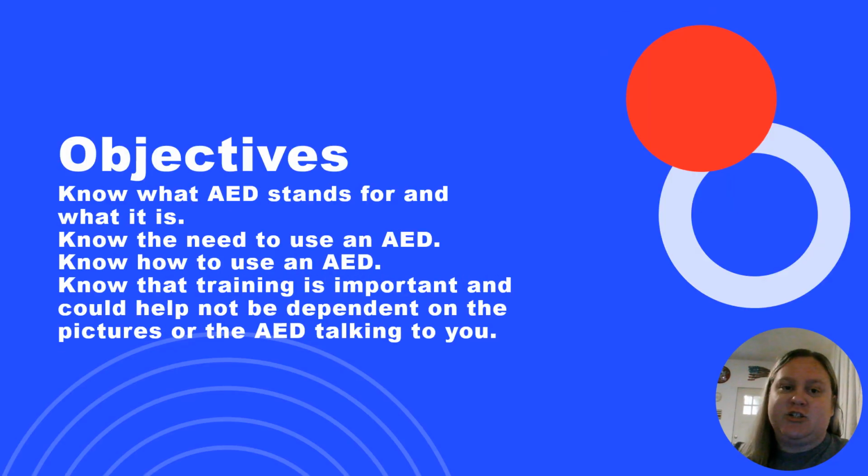All right, so the objectives of this course are to know what an AED stands for and what it is, know the need to use an AED, know how to use the AED, and know that training is important and could help you not be dependent on those pictures or the fact that it talks to you and tells you what to do.